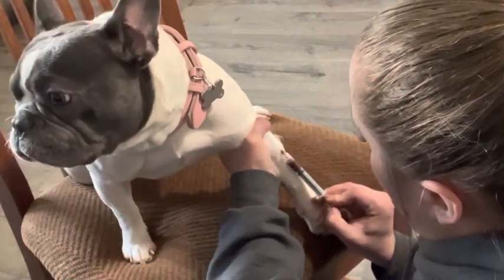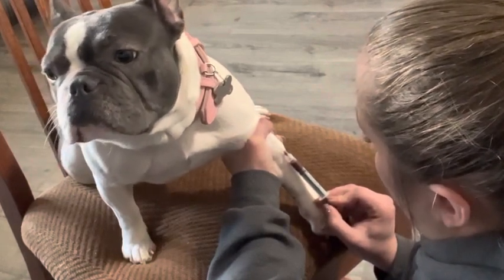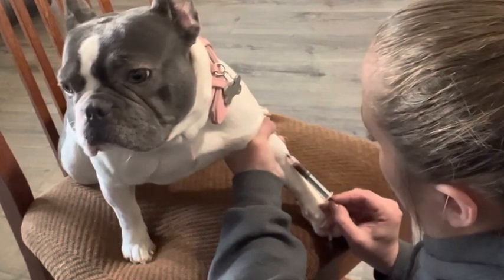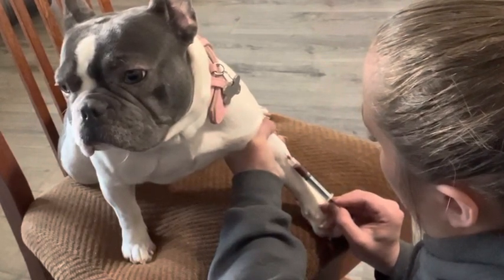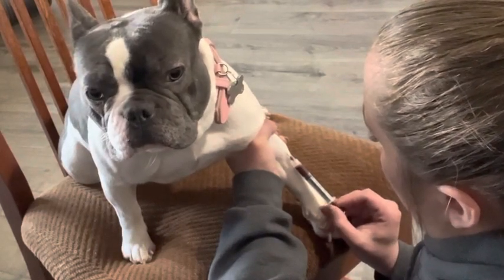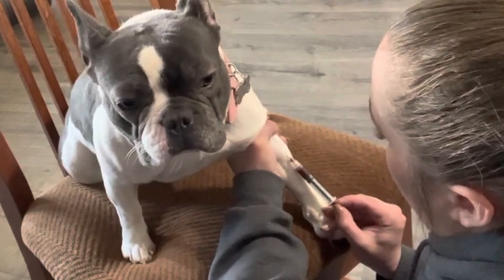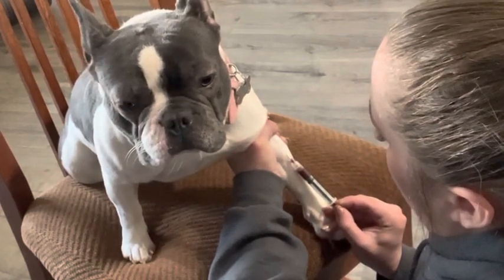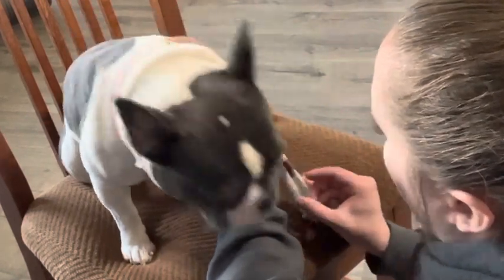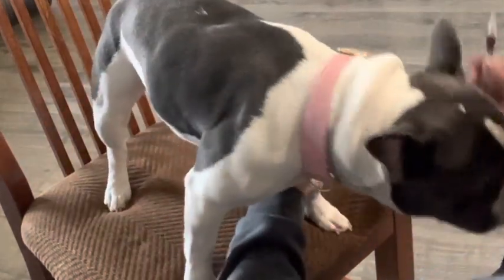Good girl, sweet pea. See what we got. So you're just going to let it drip into the syringe. We've got enough. I'm going to let go of her arm so that when I take the needle out, it doesn't drip everywhere.